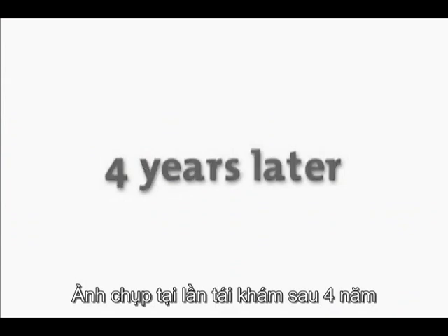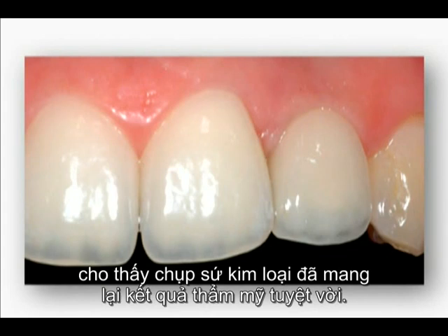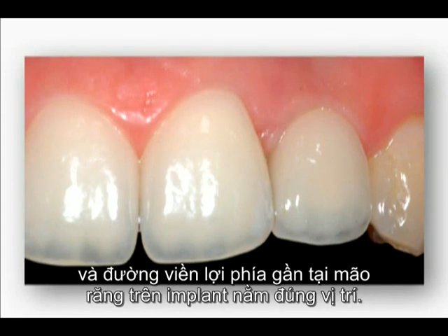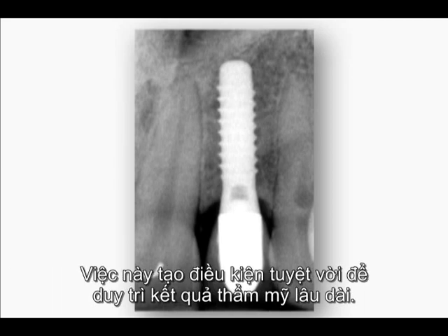The detailed view at the 4-year follow-up examination confirms the excellent aesthetic result provided by the ceramo metal crown. The papillae are fully intact, and the midfacial gingival margin at the implant crown is correctly positioned. The periapical radiograph at 4 years demonstrates stable peri-implant bone levels in the crestal area. This offers excellent conditions for a long-lasting aesthetic treatment outcome.